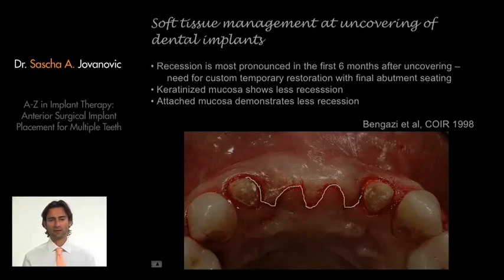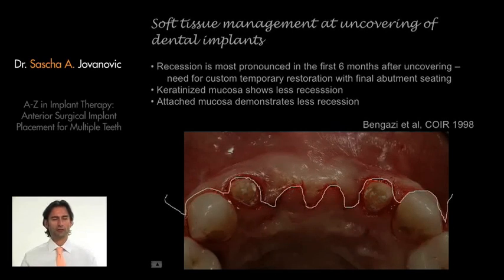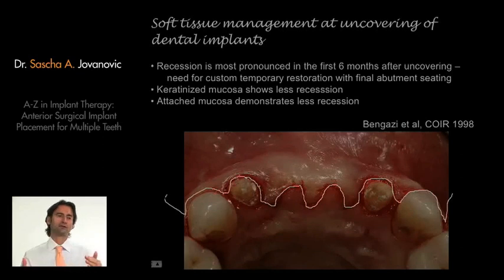Now I don't want vertical incisions here because it can show me verticals. So what I'm going to do is make the verticals distal of the canine. And the same thing I'll do on the contralateral area, as you can see here. And here's the incision. So this becomes like a curtain of soft tissue, which is moved from the palate all the way to the buccal.